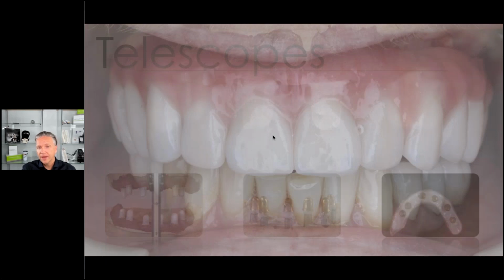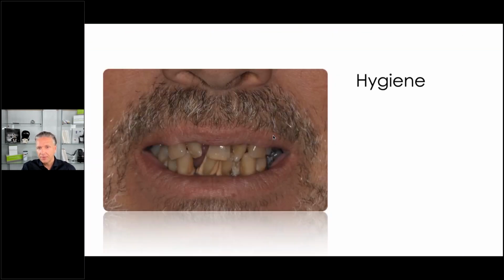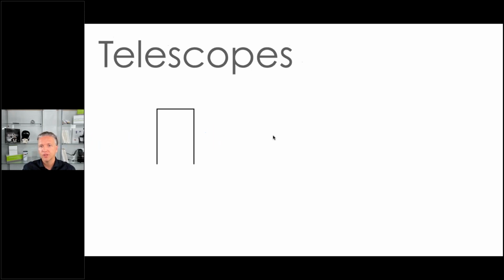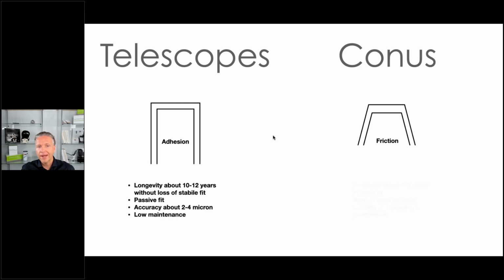So another advantage of lithium disilicate in comparison to other materials is for complex restorations, for example telescopes, where I love to use it. So where do I use it on telescope restorations? Just in this case as an example, it's a classic case, a devastating initial situation. So we're planning a full mouth rehabilitation. And I don't want to go too deep into the whole telescope discussion. We're unfortunately running a little bit short on time. So I want to show you why we're using lithium disilicate here.